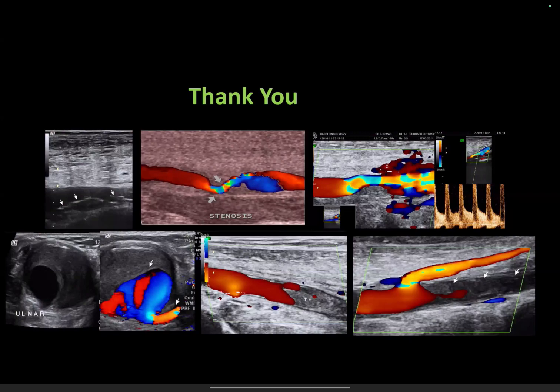When there is monophasic flow with adequate velocities and abrupt achievement of the peak systole, this is basically inflow. The inflow vessels or the proximal vessels are okay, and the resistance is low because of the distal vascular bed, which might be affected because of the digital or some palmar branches compromising in different ways, or there can be some inflammatory process going on in the distal area of the affected part, leading to more requirement of blood, offering low resistance to make it monophasic.